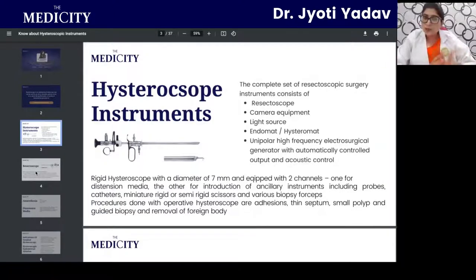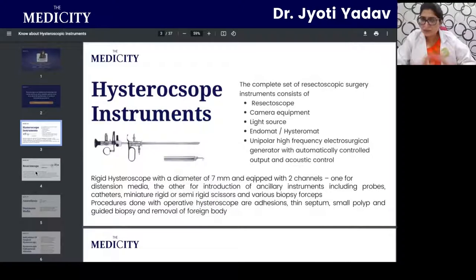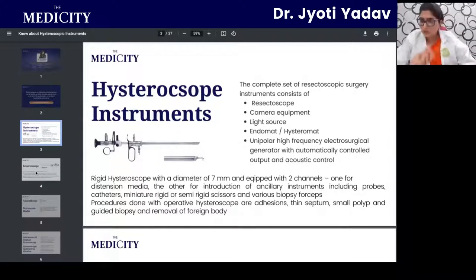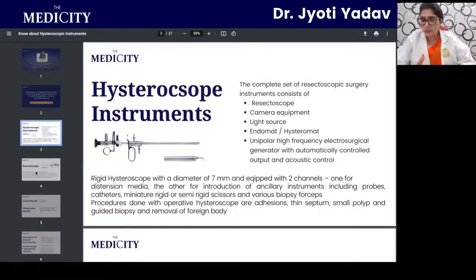A hysteroscope can be rigid and comes in different diameters. A 7 mm hysteroscope is equipped with two channels: one channel is for distension media, because without distending the uterine cavity you cannot visualize anything, and the second port is for instruments — a probe, catheter, or biopsy forceps — so one port is for distension media and one is for operative instruments.